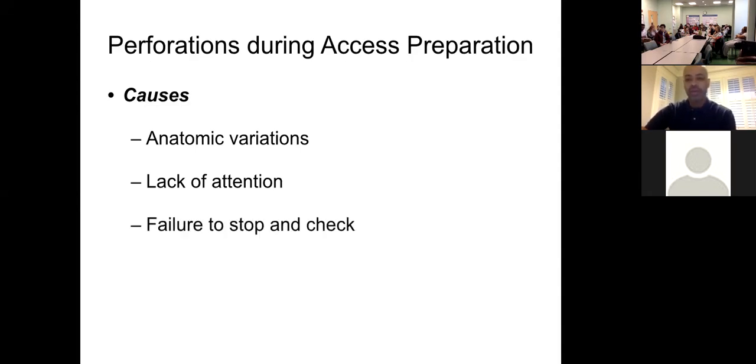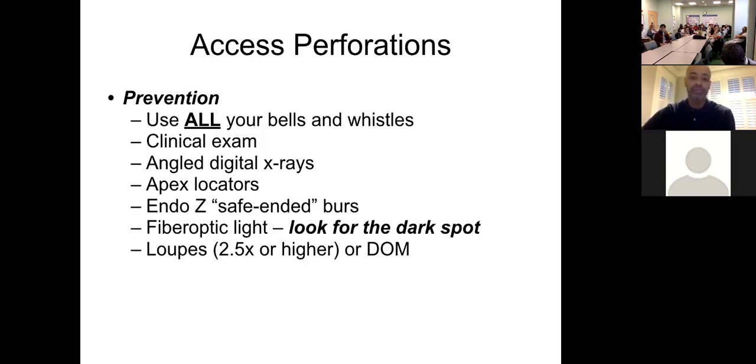I don't know if you guys have worked with Dr. Wiener yet, but he always used to tell me to stop and check, make sure I know what I'm doing. Sometimes it's best to look at the radiograph preoperatively and measure how far it is before you get to those pulp chambers, and even put a little stopper on your burr. I know that might make you feel like you're back in dental school, but trust me, I still use a slow speed handpiece. I'm not ashamed to admit it. I'd rather be safe than sorry.